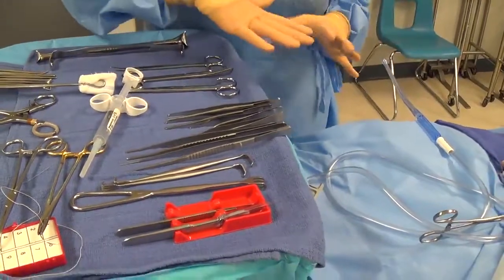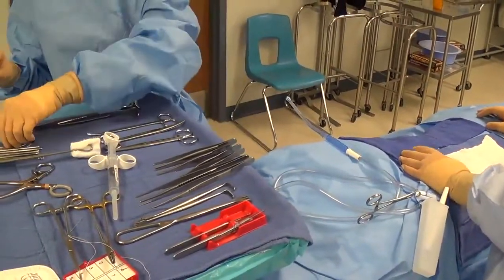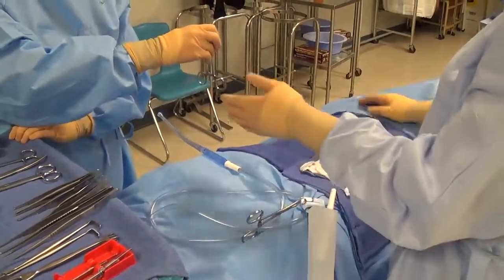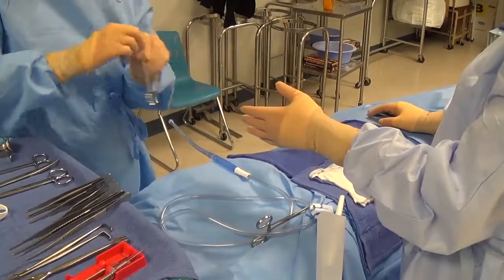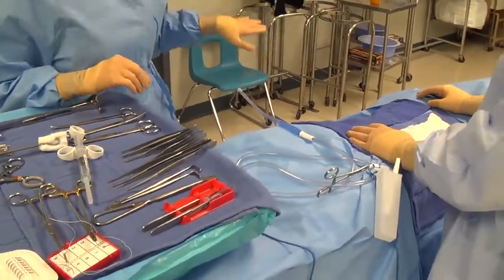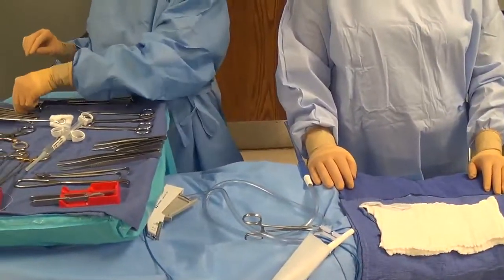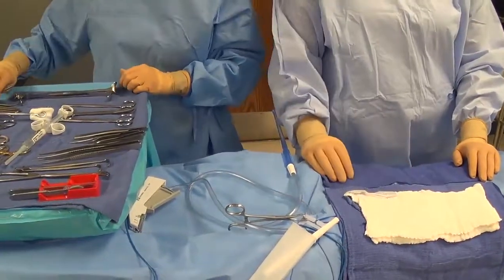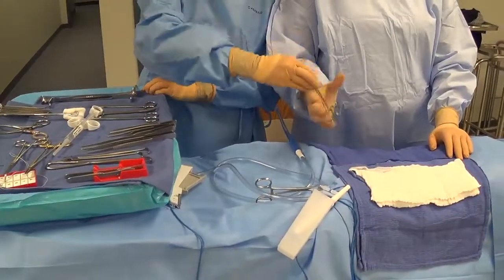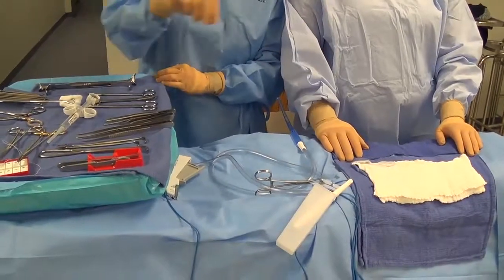When handing across the field, the general concept is right hand to right hand and left hand to left hand. But if you pick up an item expecting the surgeon's right hand and they present their left hand, don't transfer the instrument between your hands — simply rotate the instrument and place it into whichever hand is presented. If the surgeon is standing beside you, try to utilize the hand that's furthest away, as using the closer hand can cause you to bump into them. Use the outermost hand when handing items up to the field.